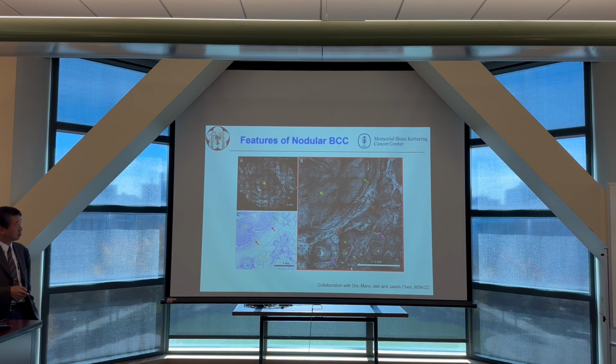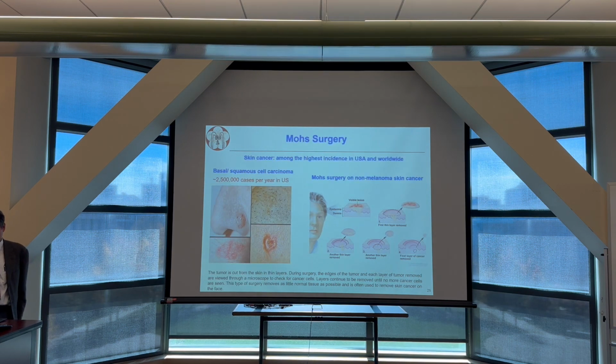Later on we had a collaboration with MSKCC, because there are many histopathologists over there, so they use our system to scan skin cancer patients. For each patient, they make a scan on the OCT, and because it's a skin cancer patient, they also have a biopsy. So they have stain imaging, and they can compare the stain imaging with OCT, and learn how to interpret this kind of black and white OCT. Right now at MSKCC, they have a lot of skin cancer patients.